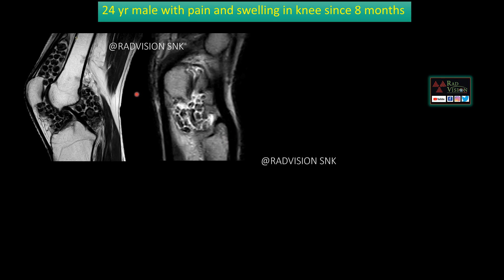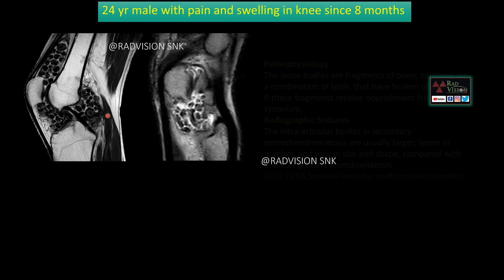Coming to the first case: a 24-year-old male with pain and swelling in the knee since 8 months. You can see there are multiple hypo-intense round to oval nodular lesions noted within the joint space, even extending into the suprapatellar recess. In another case, you can see free fluid with multiple hypo-intense rounded areas noted within the free fluid. These are classical multiple loose bodies.